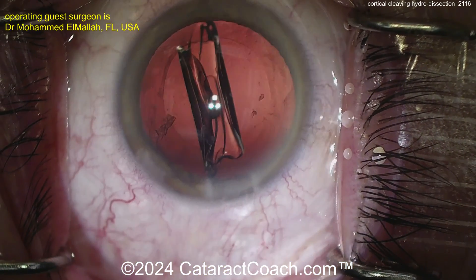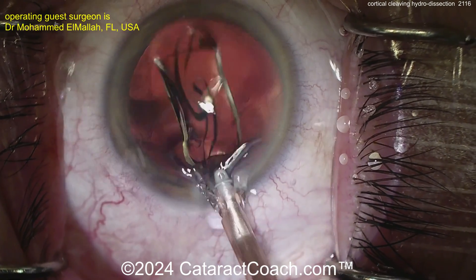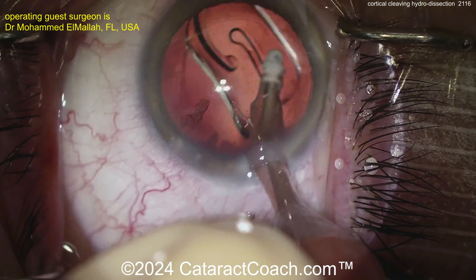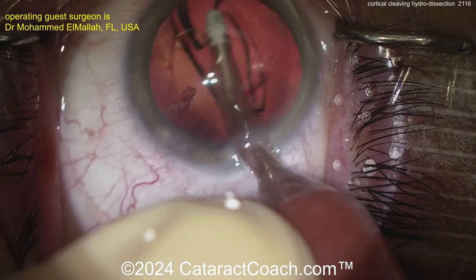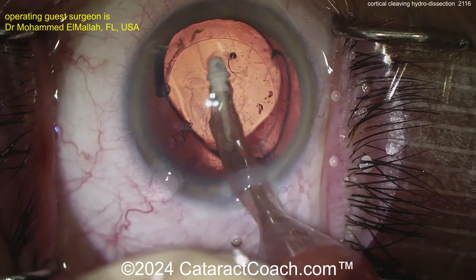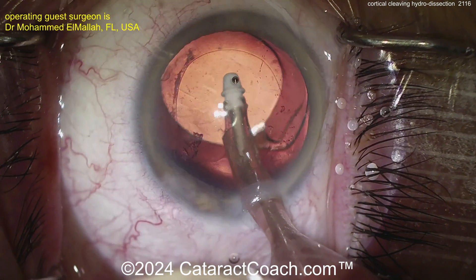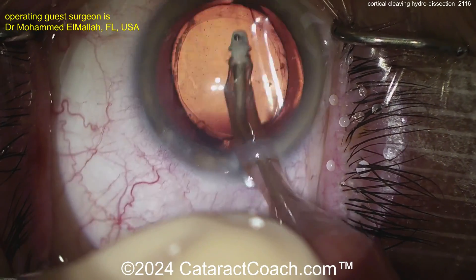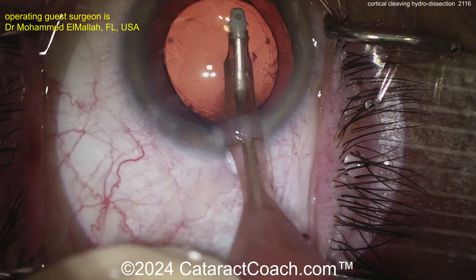If you want to try this, Cortical Cleaving Hydrodissection is not that challenging — you can use your existing instruments. One caveat: when nothing is weighing down the capsular bag, it can sometimes flop. If you have unstable fluidics and see a bounce to the iris as you aspirate lens pieces, then the posterior capsule is unsupported and very floppy. With bad fluidics it can come up and hit your phaco tip — and that's a sad story.